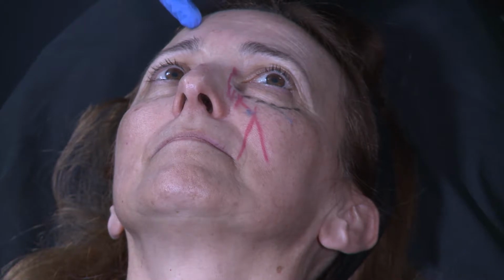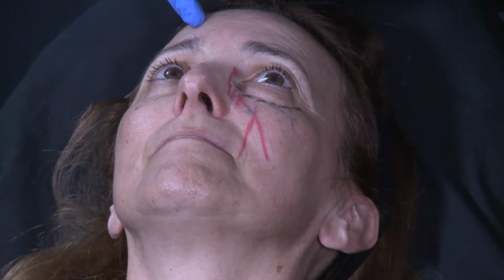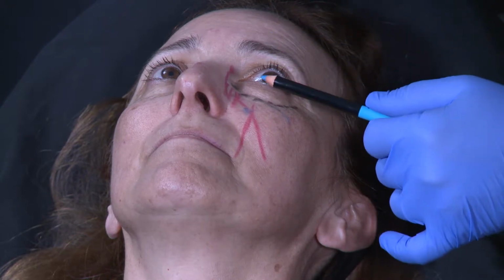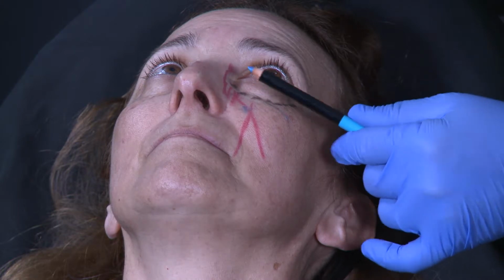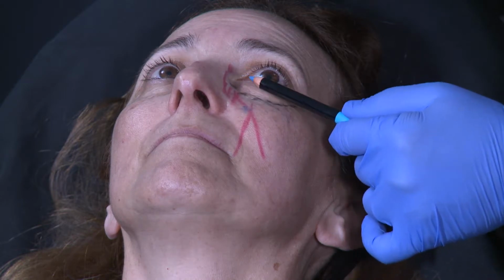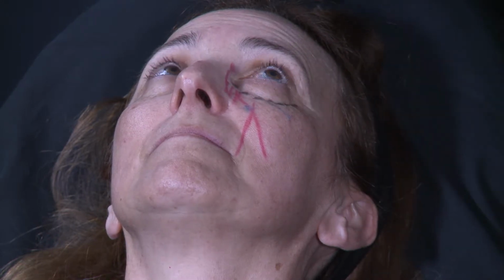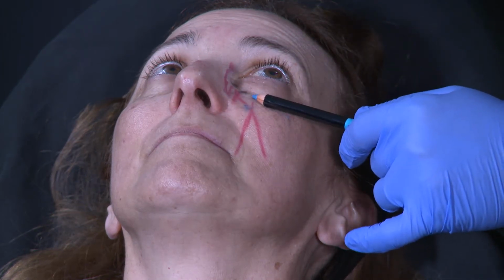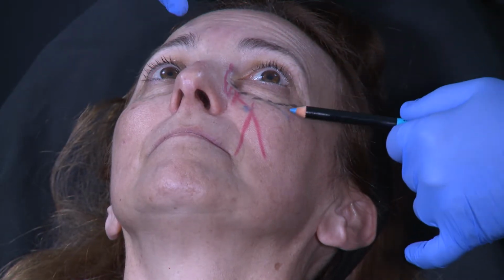Sometimes, but in touch-up, I can add a little bit of Redensity 2 above the previous injection, because there could exist a gap between the fat pad here that you see very well and what I will inject here. Between what I inject and the fat pad, you can still have some lack of volume, a little depression, and I will inject superficially in this area, but not at the beginning.